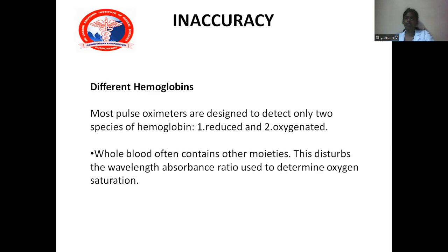The main disadvantage is erratic readings can occur with dysrhythmias, and failure to detect the oxygen saturation in conditions like ASA physical status 3, 4, or 5, whenever the patient is having hypotension, hypothermia, chronic renal failure, low saturation levels, low hematocrit levels, and whenever there is increased duration of intraoperative procedures, there will be a chance of giving erroneous reading in the pulse oximeter.